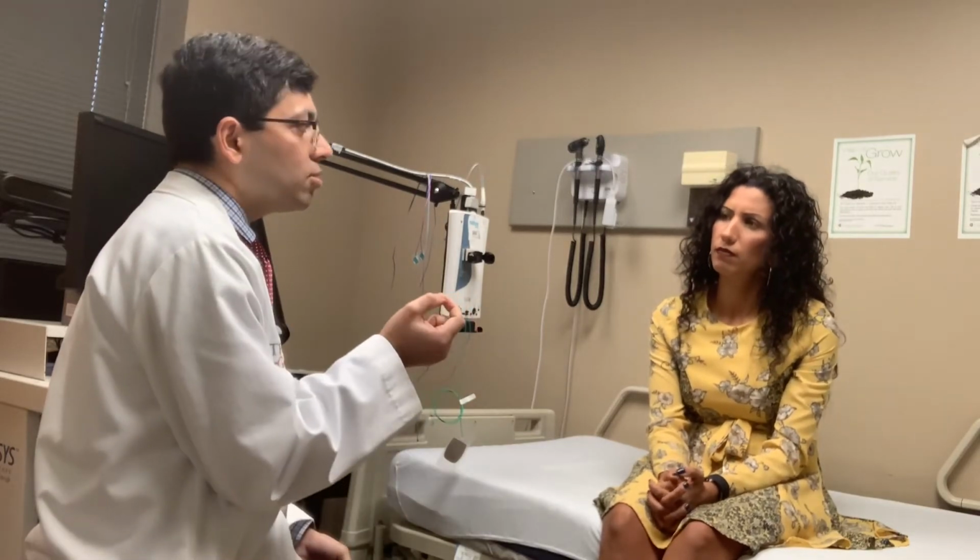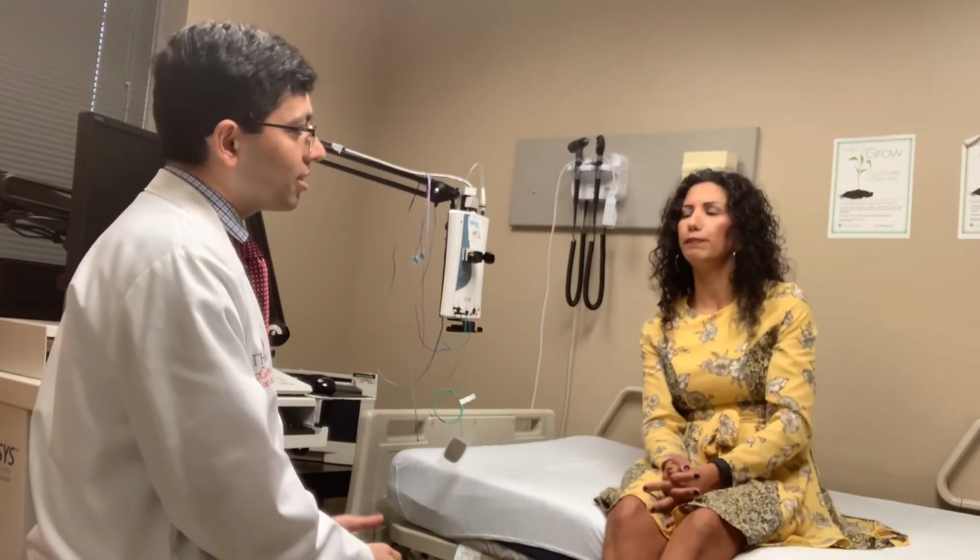Okay. I know that this sounds scary, but I can assure you that most patients tolerate this test pretty well. Is it painful? This needle is pretty small, it's acupuncture size. I would not say painful or not, but yes, as it sounds, this is an uncomfortable test. But as I said, most patients do tolerate it very well.